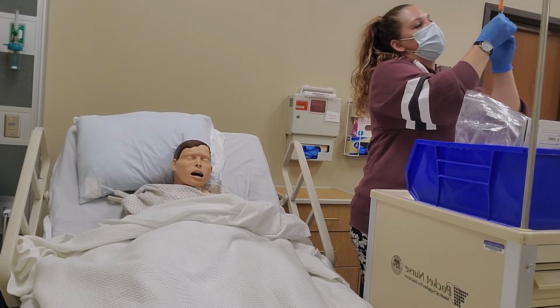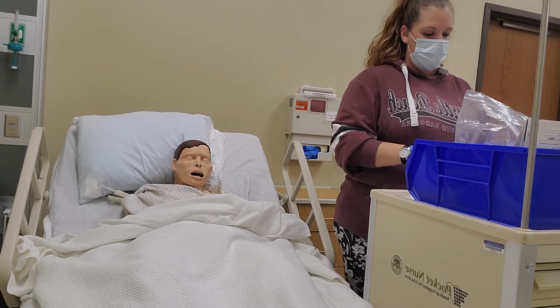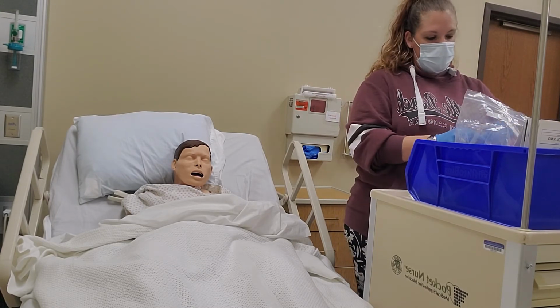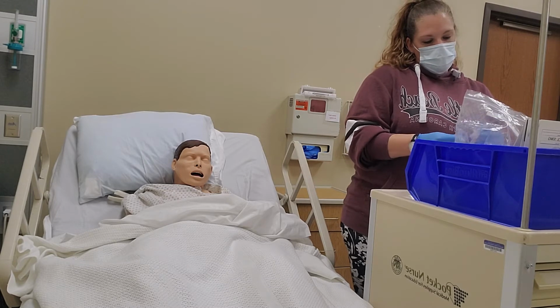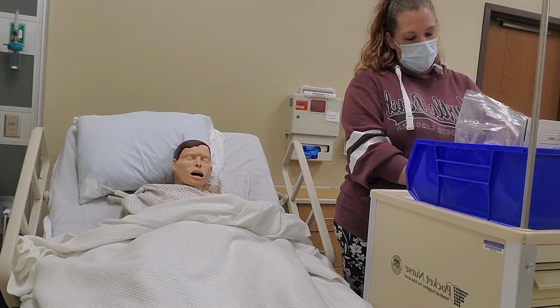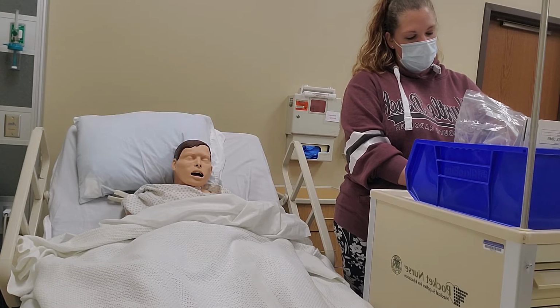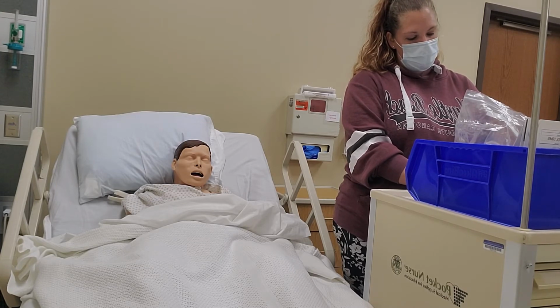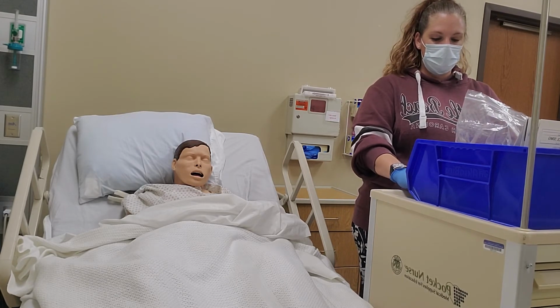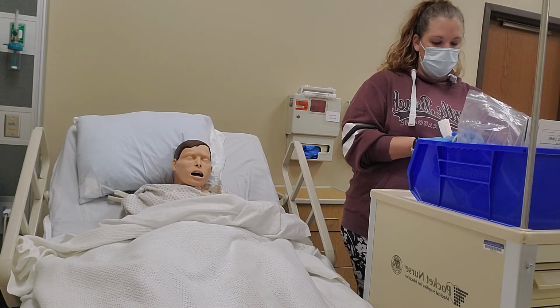It's okay to get more than 10 units of air too. Okay, I'm gonna grab an alcohol swab. And I'm gonna clean off each vial, about 10 to 15 seconds. Okay. Toss this in the garbage.